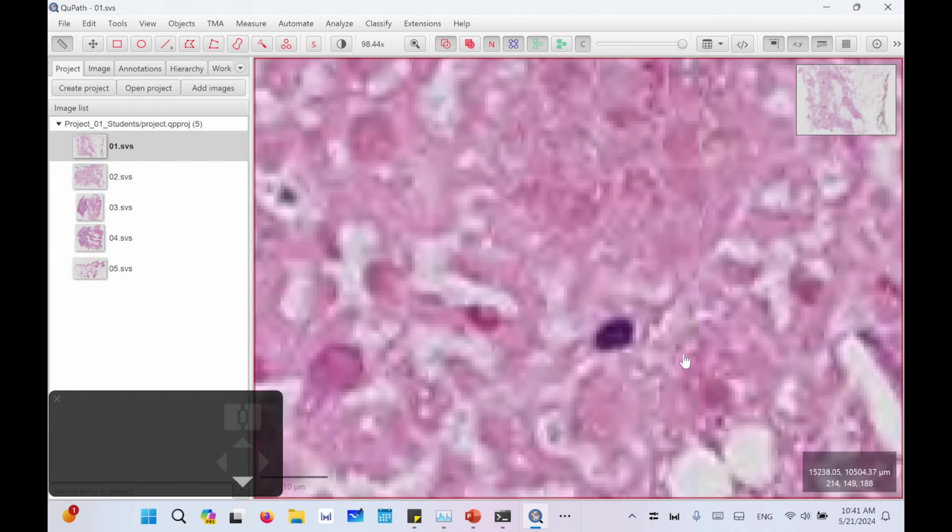So visually you can play with the brightness and contrast to visualize the different nuclei for an image, or the cytoplasm, or adipose, or the extracellular structure as you need.